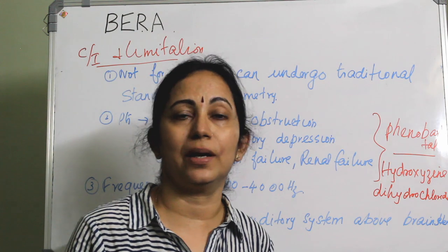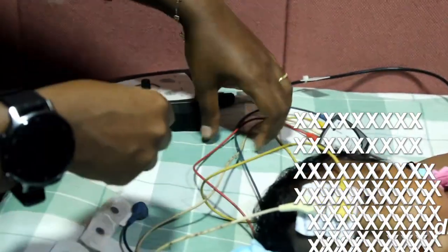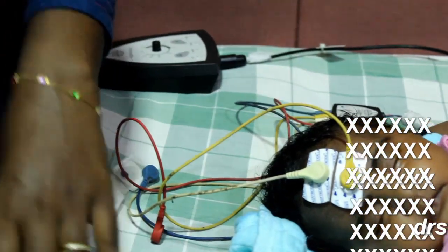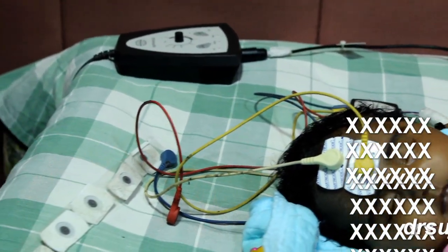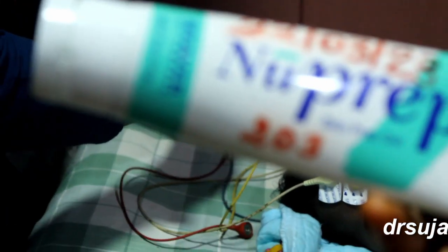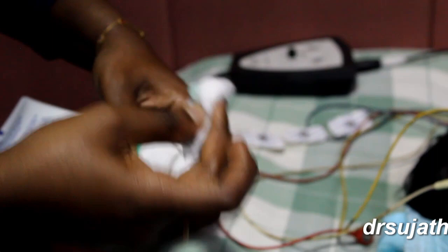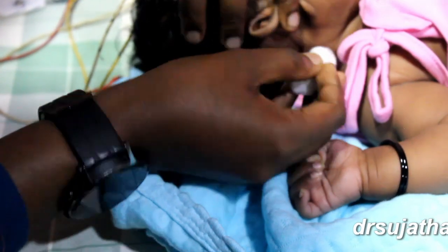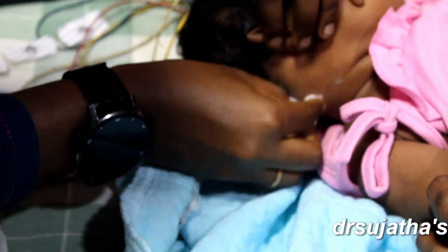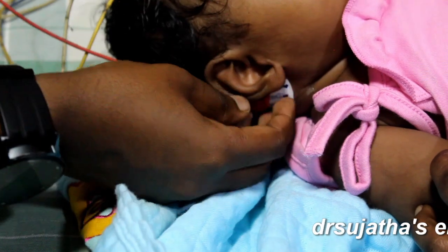Now you can see how a BERA is done in a child. In ABR, electrode placement is important. White is the vertex electrode or the high forehead. Yellow is the ground electrode kept at the low forehead. Red is on the right side and blue is on the left side. And NuPrep is the commonly used skin preparation solution. This skin has to be cleaned thoroughly before placing the electrode. Otherwise, the impedance, the resistance, will be very high and it can alter your test result. So clean the area thoroughly and place the electrodes.